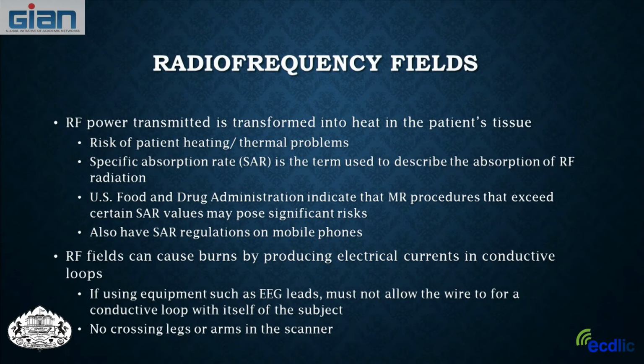Heating and burns. We don't want the person to touch the bore of the magnet. That can also lead to burns. If we have a big person and they're very tightly fit in there, sometimes we'll put padding between their arms and the walls of the magnet.